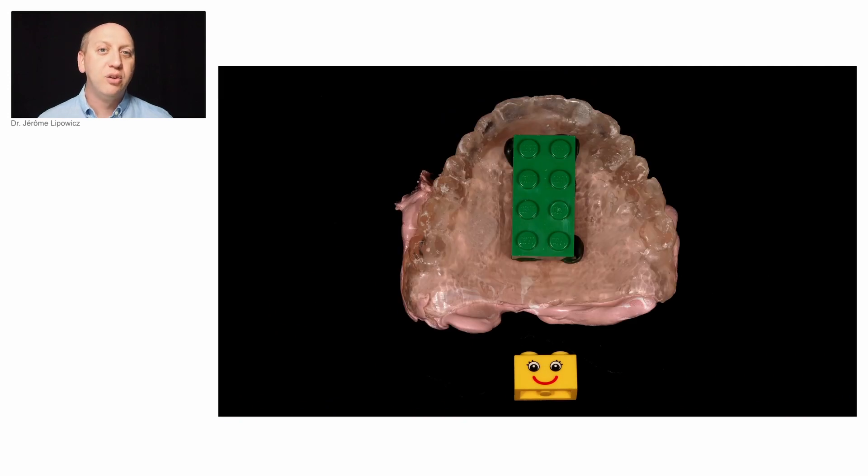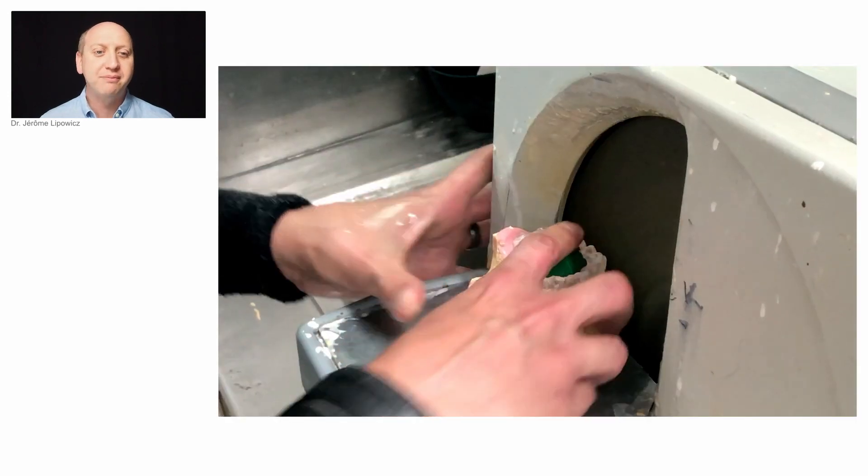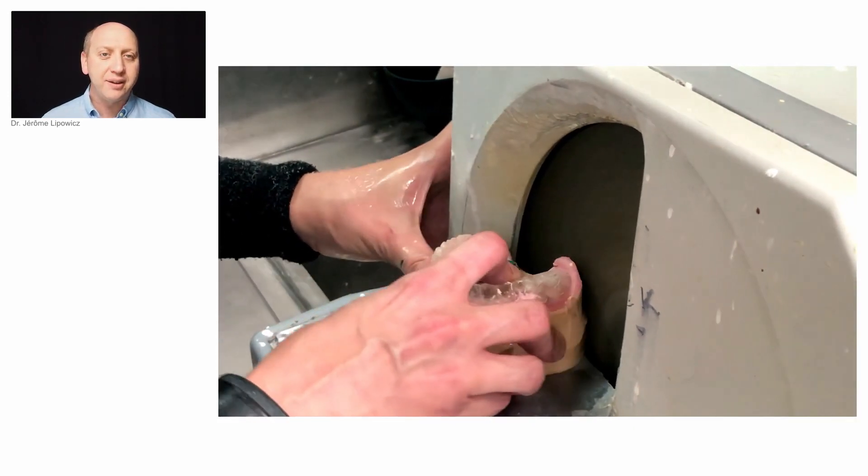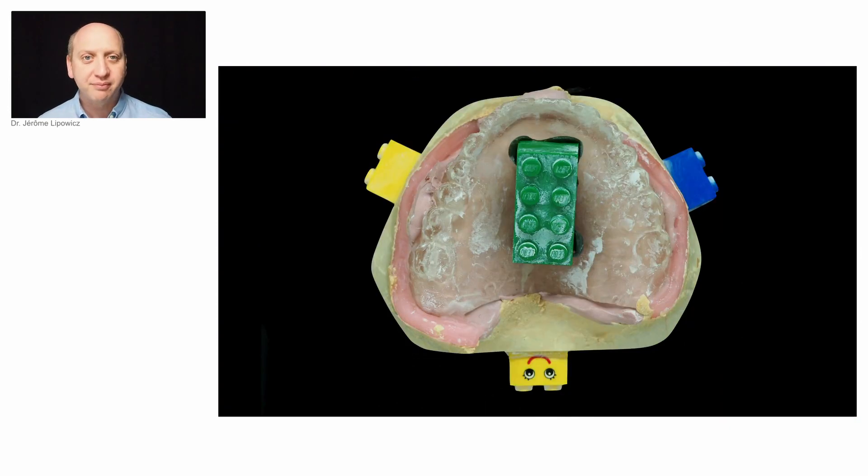Next, we need more Lego bricks. We need a plaster model that is prepared by the dental technician. With the dental technician, we glue three Lego bricks on the base of the model, just like this.